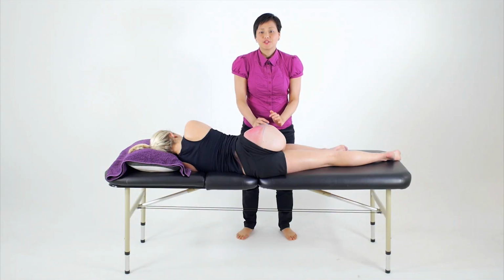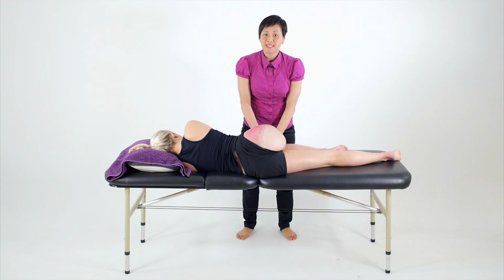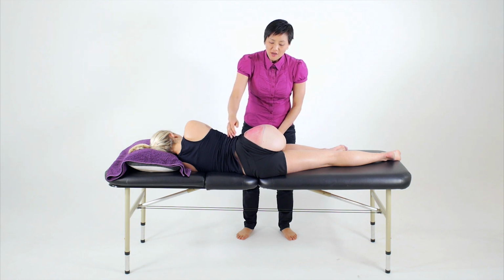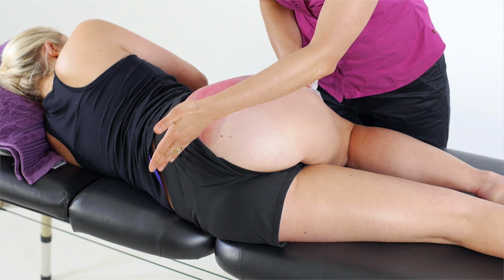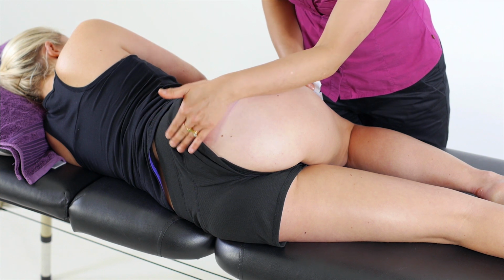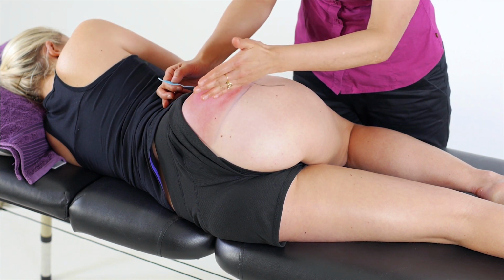For a length application to the posterior fibers of the gluteus medius, what we'll do is position our client in a side-lying position. So with the lower leg extended, we'll adduct the hip across the midline by resting the knee down on the bed. From here, we're going to consider the fiber orientation of those posterior fibers, and think about the line from the posterior superior iliac spine coming across into the greater trochanter. So we're thinking about these fibers here.